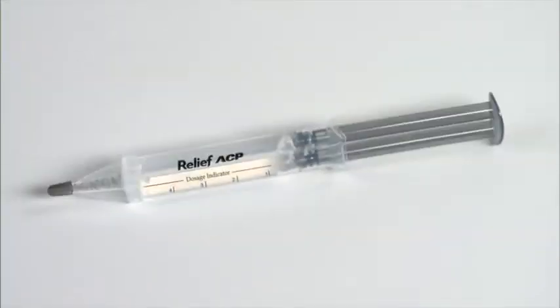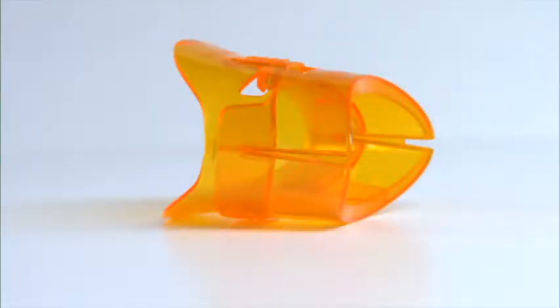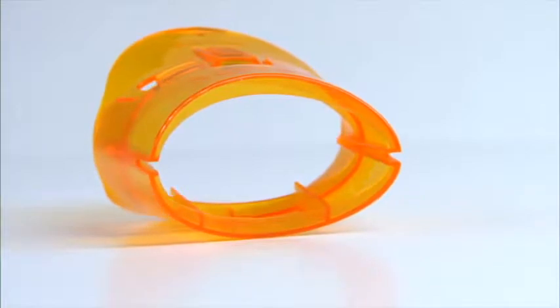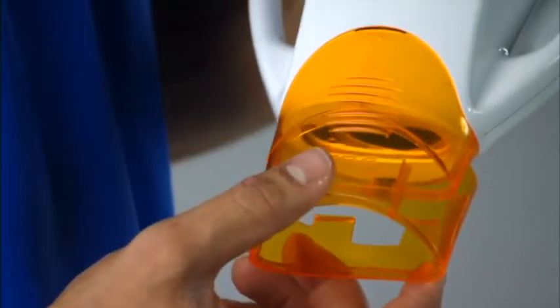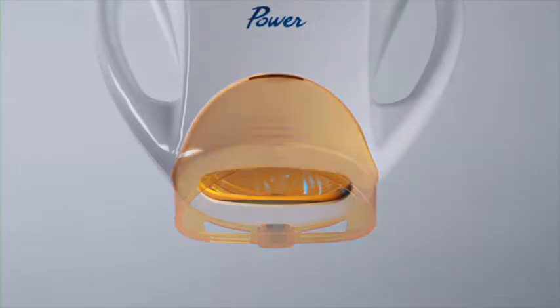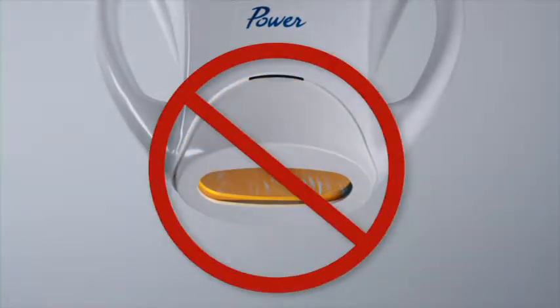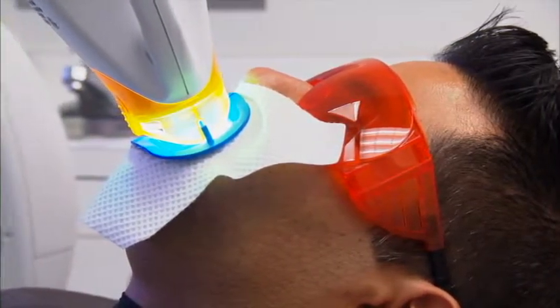For sensitive patients, it's recommended to use the included Relief gel and incorporate the optional Zoom Light Guide extender. The Light Guide extender is available from your Discus representative. To attach the Light Guide extender, pull back the lamp head and attach the Light Guide extender over the light guide while making sure it's not detached from the lamp head, or the session will be canceled. It's important to note that using the Light Guide extender may reduce results. Therefore, a 4th session may be needed.